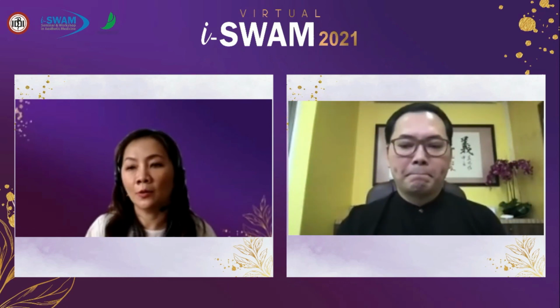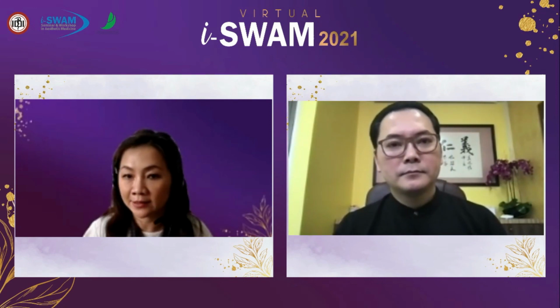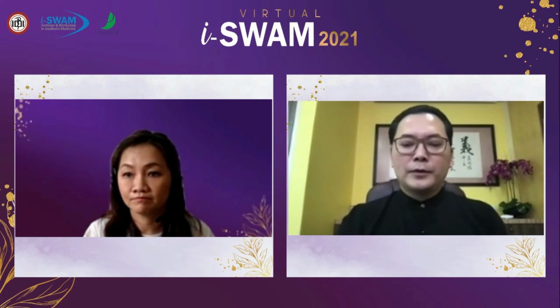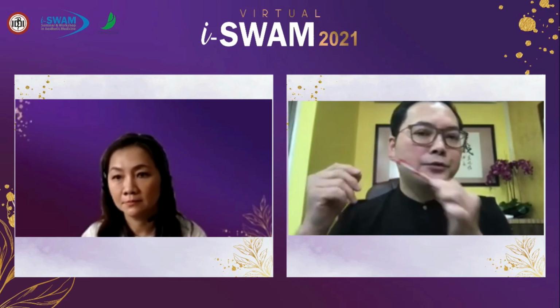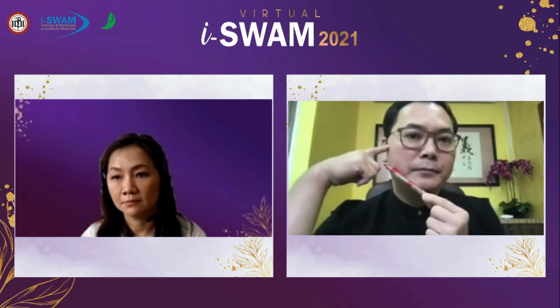Okay. What if there is a protrusion of the thread and there's no sign of infection? Do we keep the thread or do we have to pull the thread? Oh, good question. So whenever there is a protrusion, try to open a small hole with the needle, catch the protruded thread, try to pull the thread and see whether the fixation point has already loosened or not.